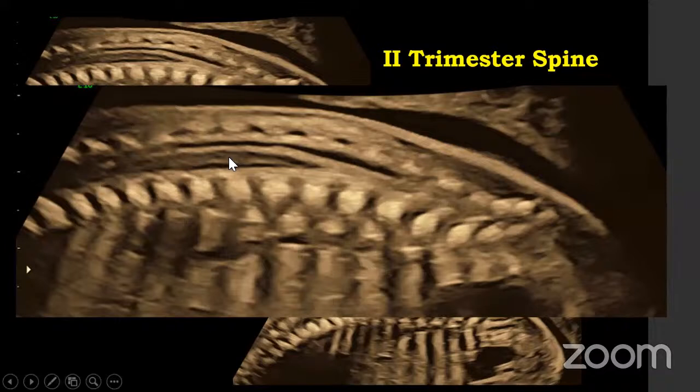Now coming anteriorly, I am seeing the spinal cord, I'm seeing the cauda equina, I'm seeing the filum terminale, and I'm also seeing the neural canal. So you can appreciate subtle important structures. And in cases of tethered cord, you can count the level of the conus medullaris, and you can also appreciate the neural canal, which is obliterated in a tethered cord. So you are appreciating the conus medullaris, the filum terminale, then the neural canal. You are appreciating the upturning of the sacral spine, intact skin. This completes evaluation of the lumbosacral region of the spine.